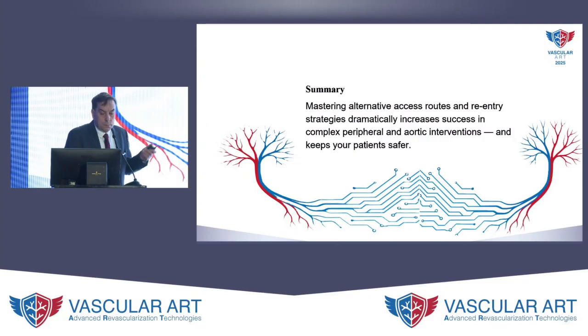So access routes from the radial and brachial approach are well-known alternatives to the groin approach, especially in difficult groins, in patients who require another, let's say, third access in complicated cases. And everybody should try it if there are difficulties in the access from the groin.